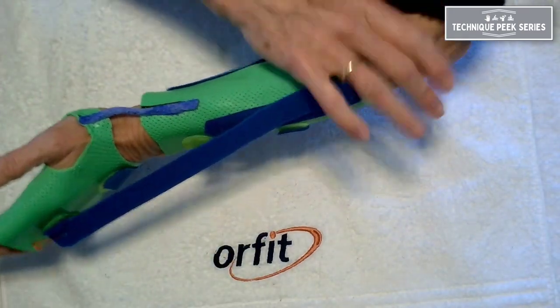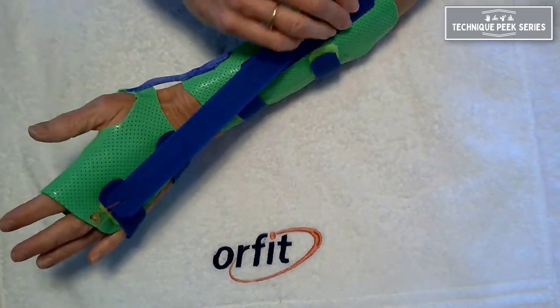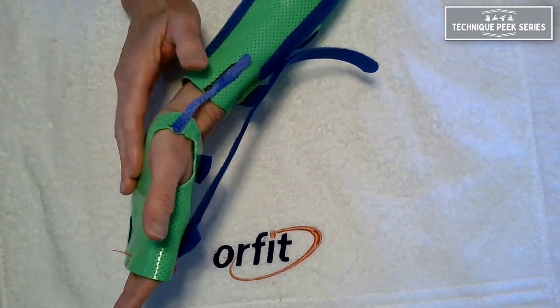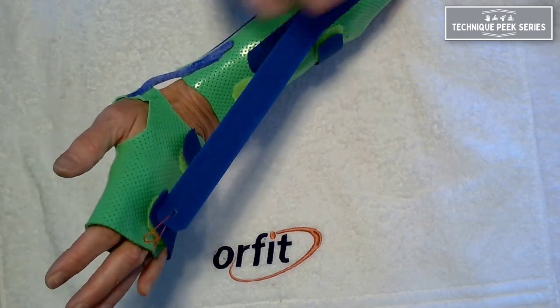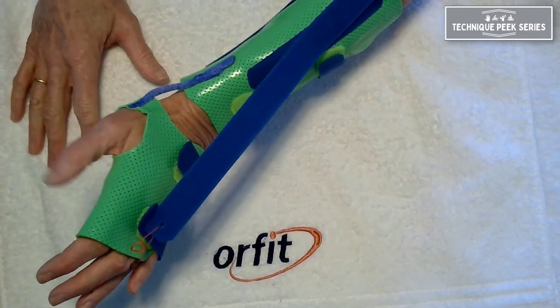If you wanted to include the elbow you could put a strap around it to keep it flexed, but I find that for people wearing this three to four times a day for 20, 30, or 40 minutes at a time, they can remain pretty stable. It's not going to shift distally because it's a great circumferential design, so it really stays put.